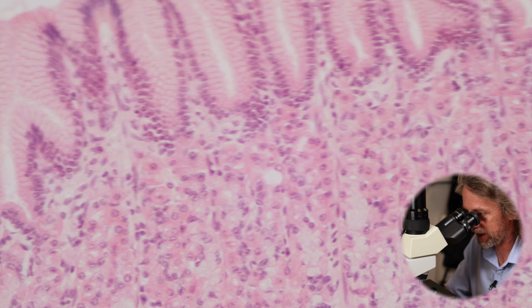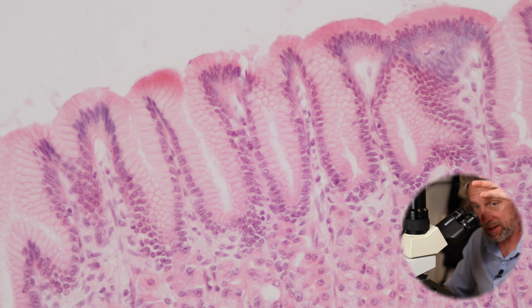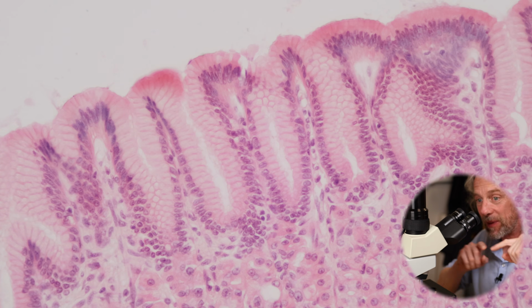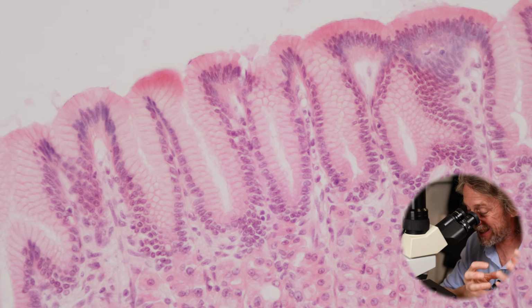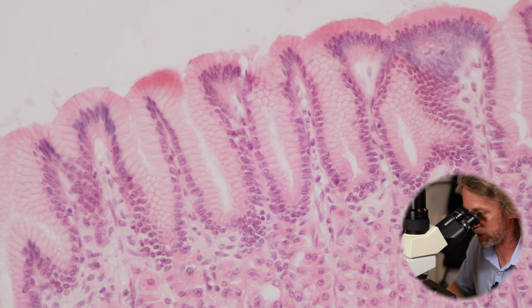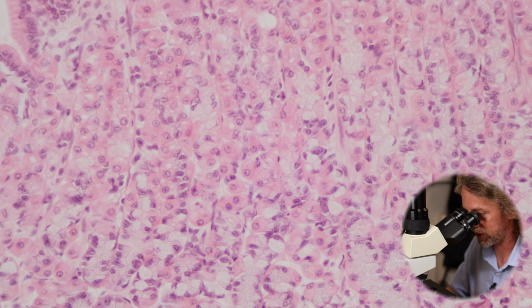But the concept I need to get across is that these gastric pits are these little tiny tubes extending down from the surface, and really they continue and they branch into different directions, and the gastric glands, the cells, secrete their secretions into really the deeper parts of the gastric pits, which we would call the gastric glands. So the gastric pits are near the surface and the gastric glands are down here.